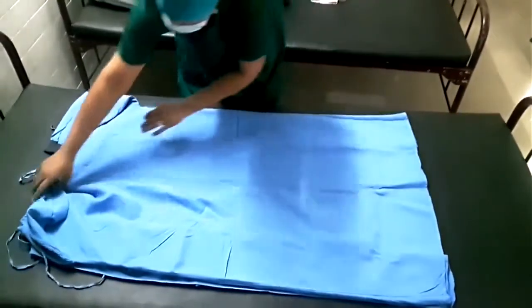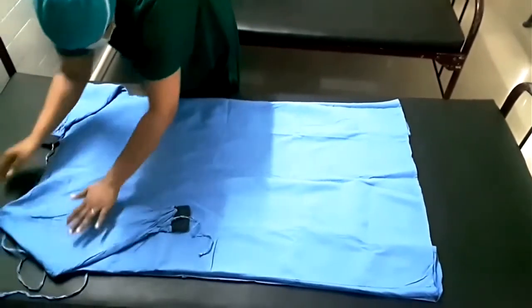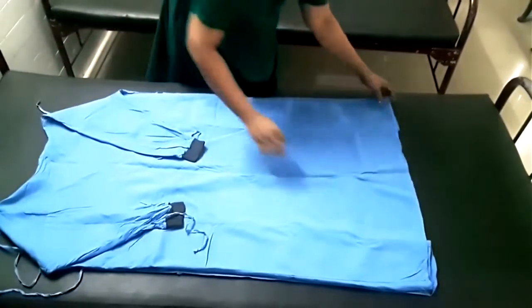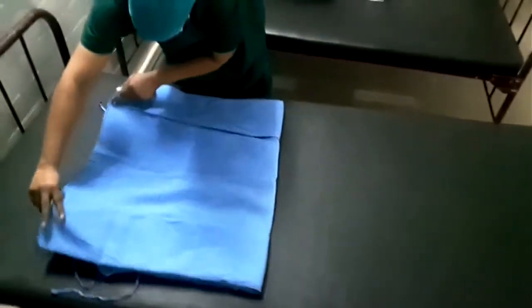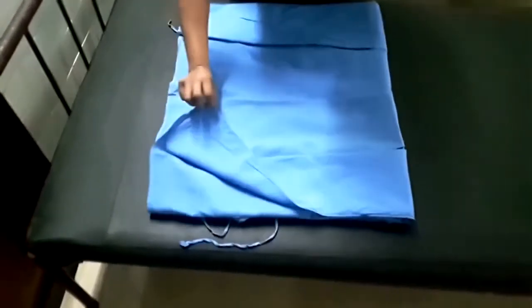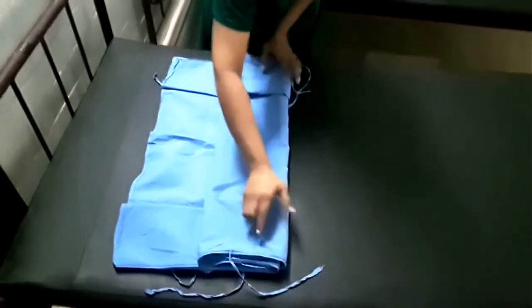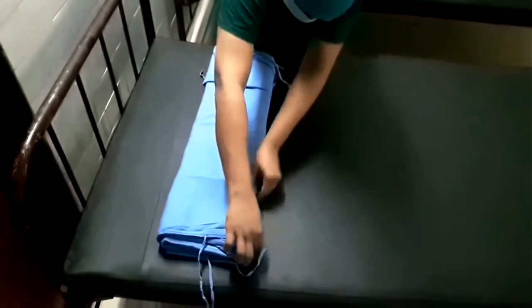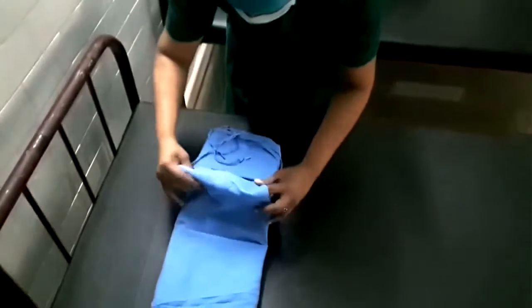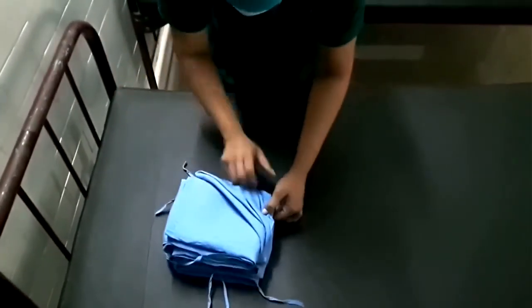Then put the arm in front. Fold the entire thing into half. Hope you get a clear idea how it is being done. Now fold it into three. Right? So far. Now lift the center part of it so that a W-shaped fold is created. Right?